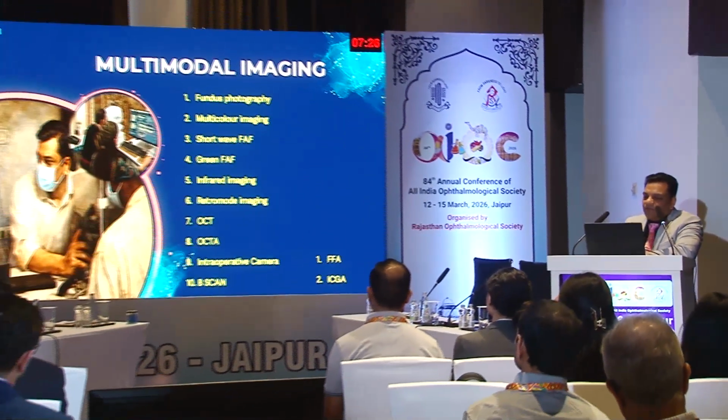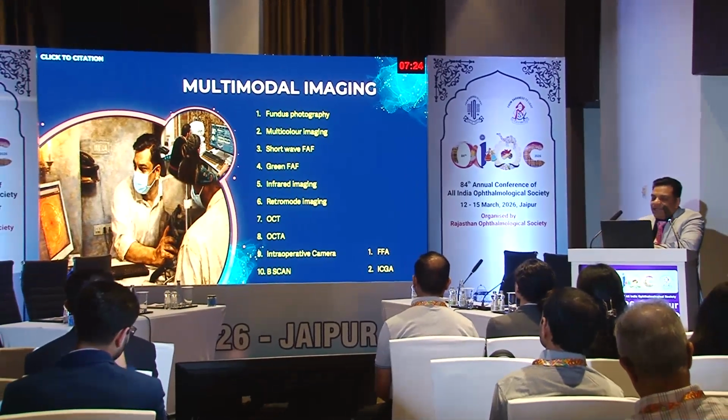As you know, retinal imaging is the backbone of retina practice. And now there is a shift. It's not just fundus photography anymore. It's a shift to multimodal imaging now. Along with fundus photography, you also need to do the OCT, OCT angiography, etc. So it's not like you're just imaging the retina, you're also interrogating the retina, which involves a complete detailed examination.